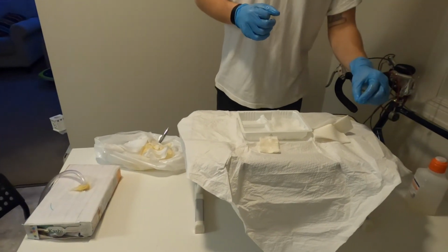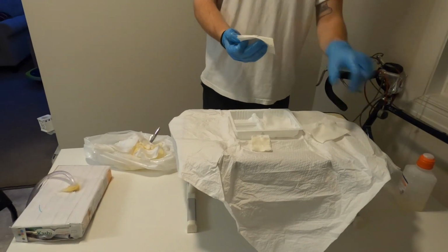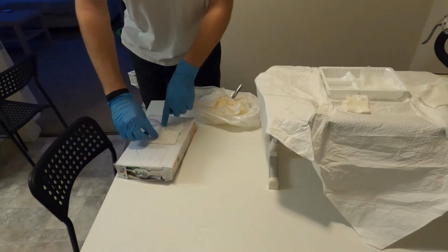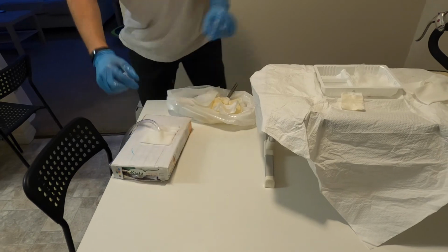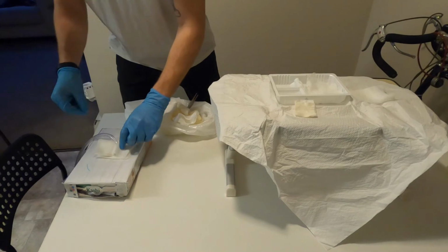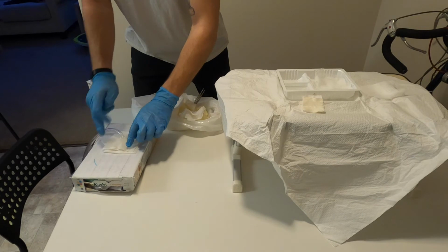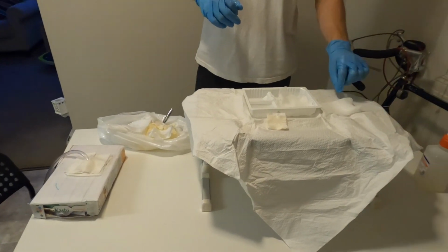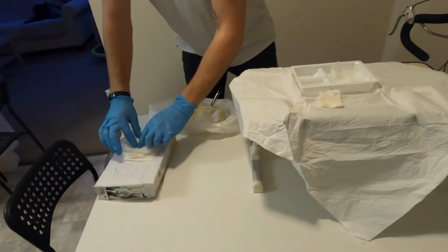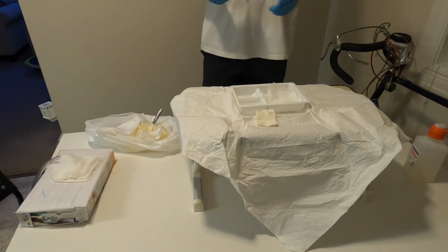So next I'm going to put on my first piece of drain sponge here. So this first one will go on this way, like so. And the next one come on through here, perfect. And one piece of 4x4 gauze will go on top of that. And then I can apply my Fixomull here.